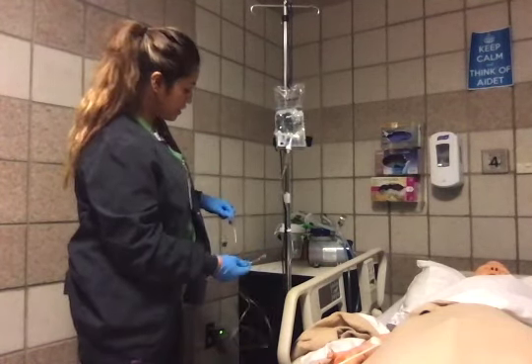Okay, and then I'm going to lower this to fill the chamber just part way. This needs to be open. Okay, so it's not all the way, I can still see the dripping from the antibiotic. And we can open this back up. Okay, so that is set up.